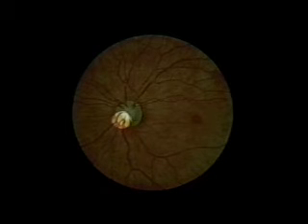Note the color of the optic disc, the clarity of its margin, and the size of the physiologic cup. Normally, the disc is yellowish-orange to creamy pink and round or oval with well-demarcated margins. It may be surrounded by white or pigmented rings or crescents. The optic cup-to-disc ratio is usually less than 1:2.